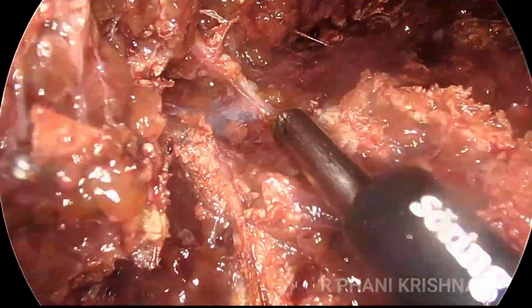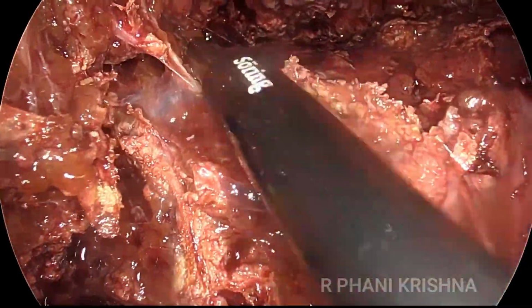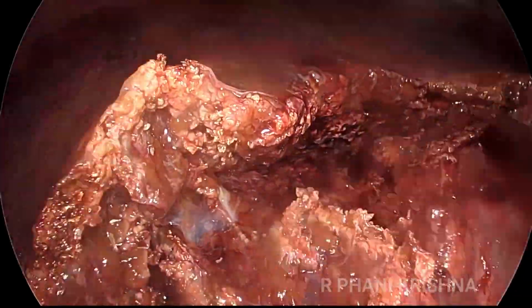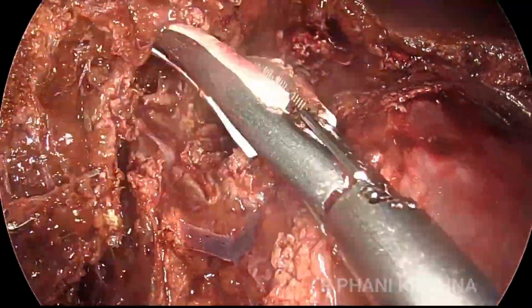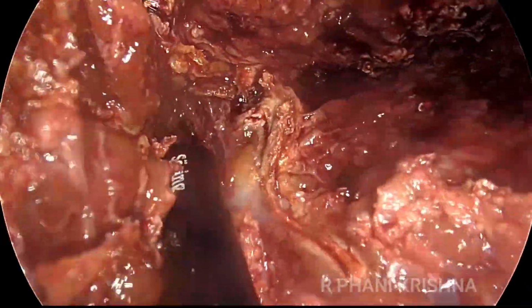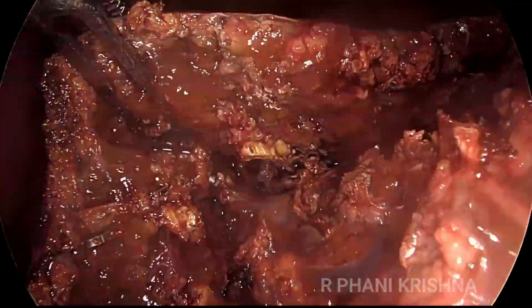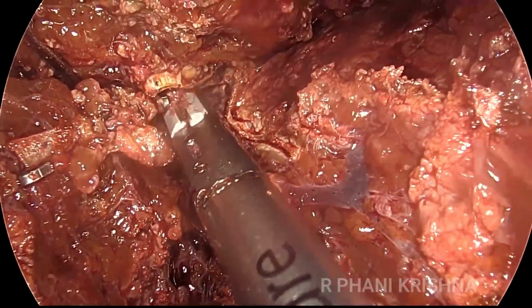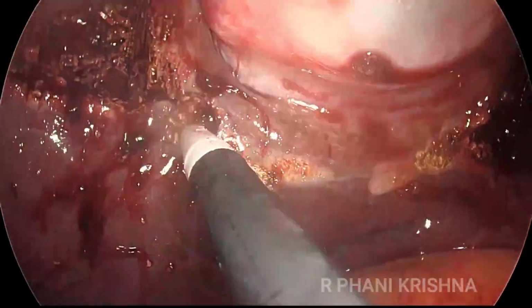Again, you can see as we go to the superiormost part, another venous tributary we are able to see, which we are clipping and dividing. Of course, this video is, I think, going at 2.5x speed, but all this part of the dissection is to be done very meticulously to avoid any accidental injuries to the veins and avoid bleeding.